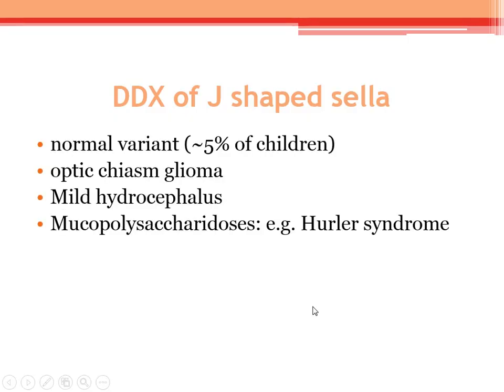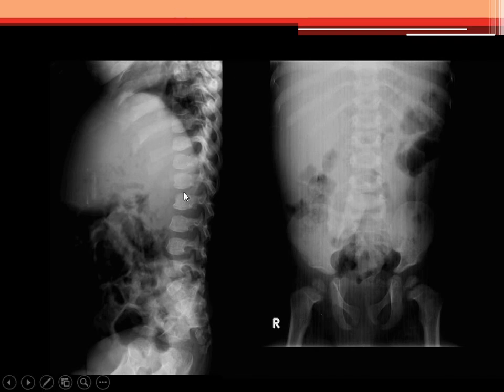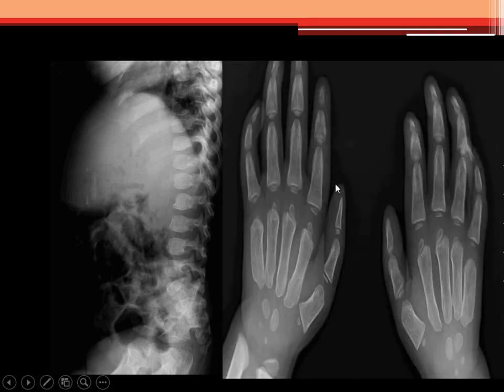Let me show you the normal-shaped sella to compare. We then did further X-rays — spine AP and lateral. The main concern shows beaking. Dr. Ahmad says inferior beaking, not central, and that distinction matters. There is beaking and hypoplasia of the vertebral bodies — they are not a normal shape. Inferior beaking is most obvious here. We also did a hand X-ray showing proximal pointing of the metacarpals, pointing toward one differential.